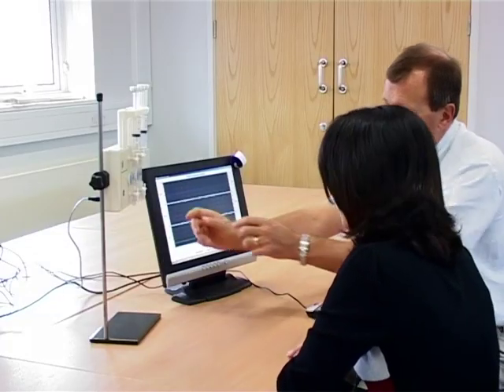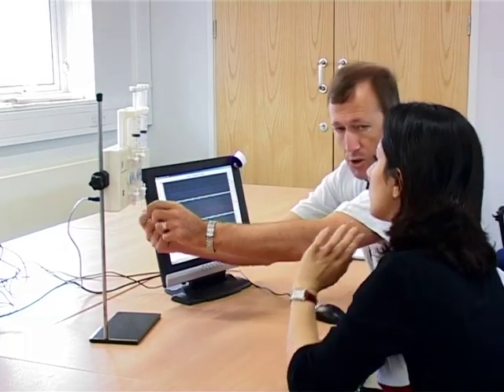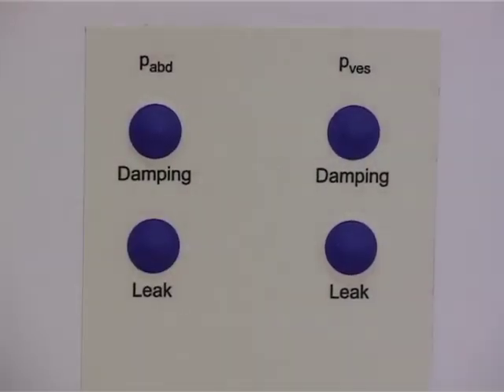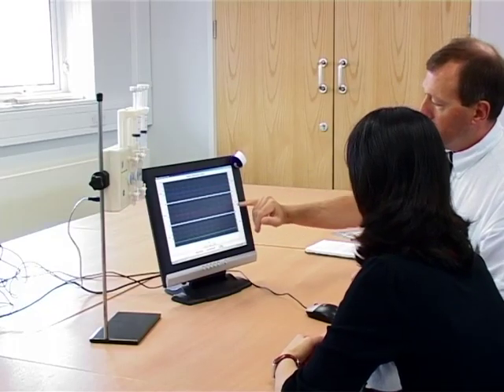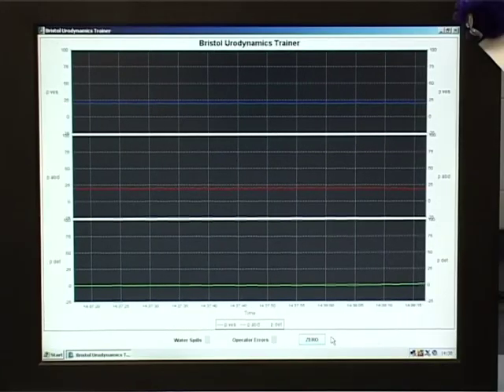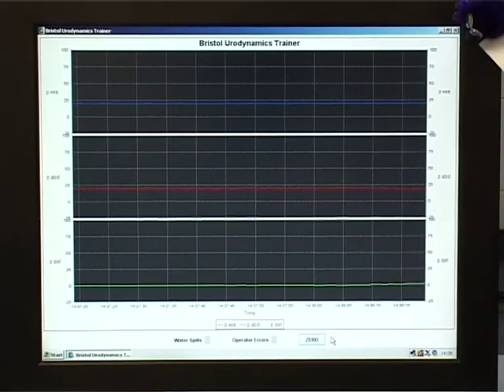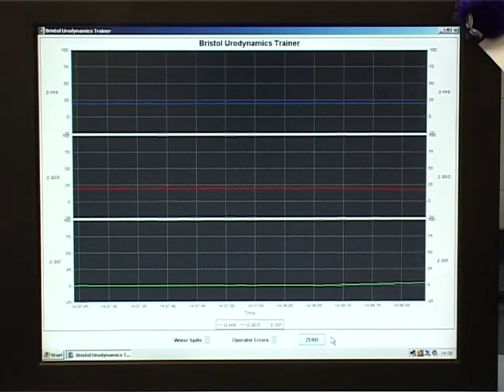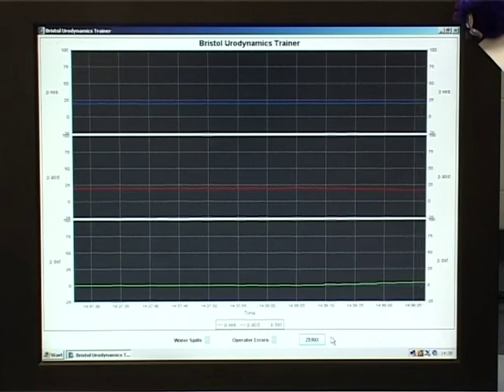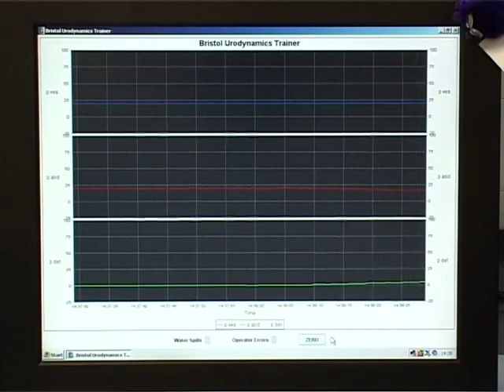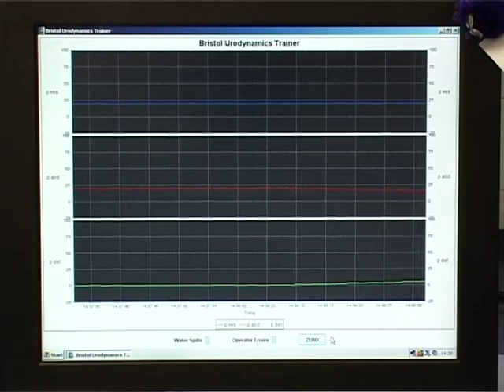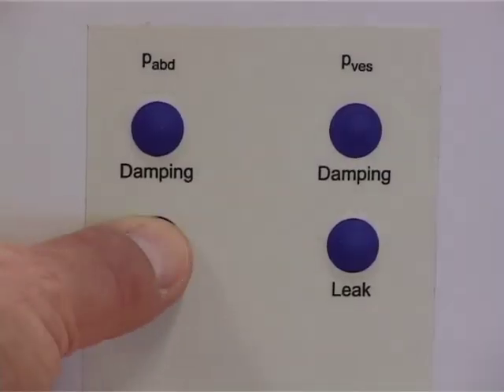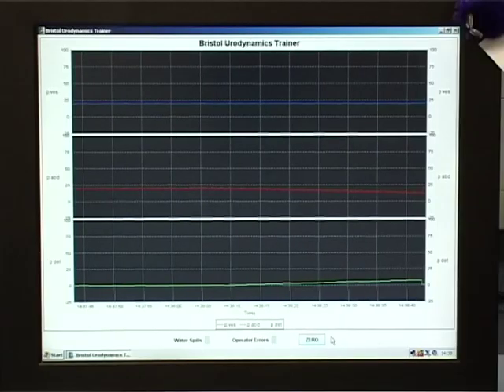Another issue that occurs during real urodynamics testing is a leak in the water line. The trainer simulates this by pressing one of the leak buttons on the rear. The pressure on the selected line will fall slowly as if water is leaking from the system. The trainee will need to recognize this and explain how to remedy the leak. The trainer then presses the leak button again to remove the simulated problem.